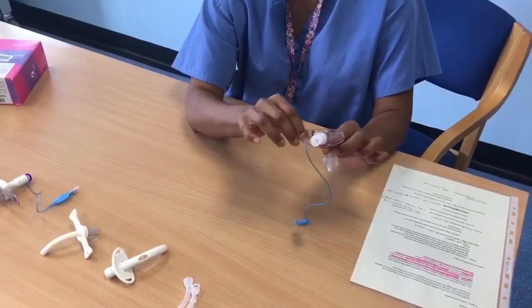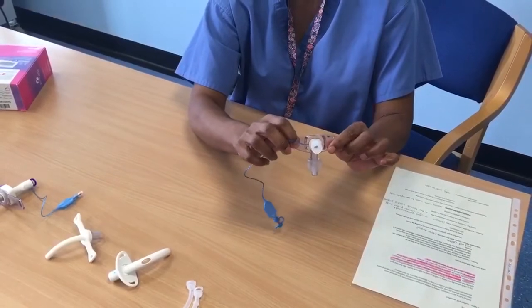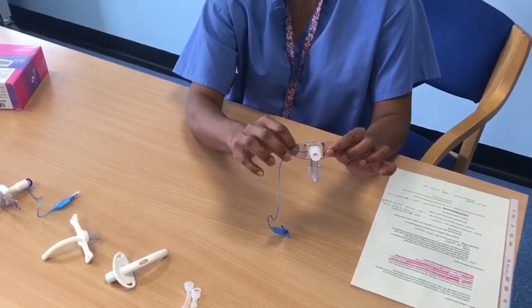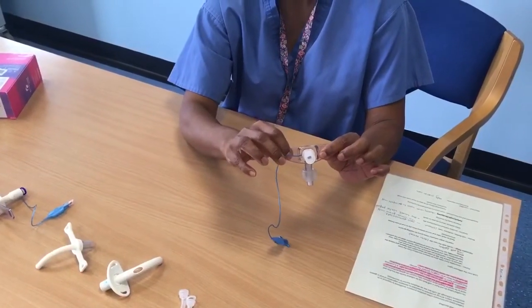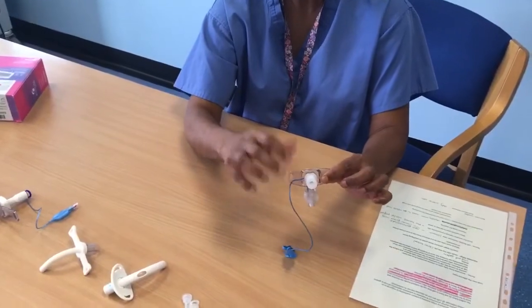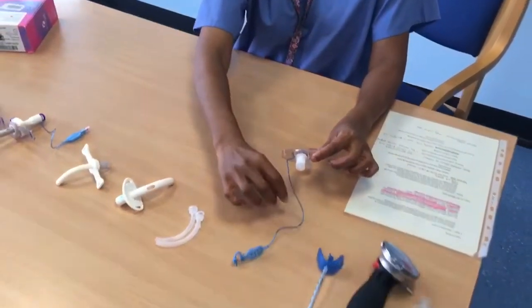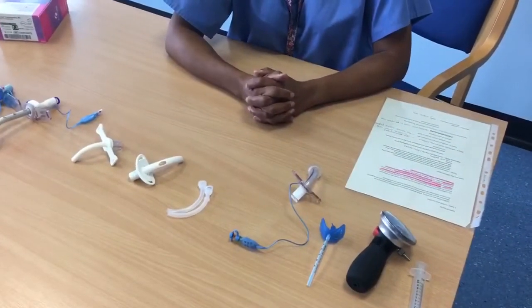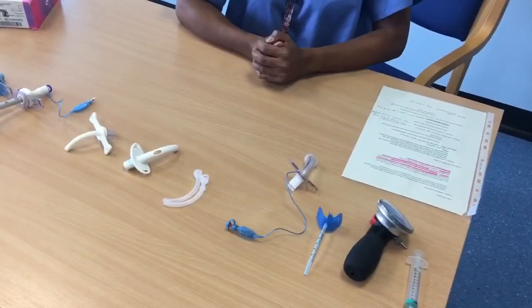In the old days, we only had one spare inner tube, so we had to be extra careful and make sure that we didn't dispose of the extra tube by accident. Nowadays we have spare inner tubes, inner cannulas, at our disposal instead of just the one inner tube being supplied.